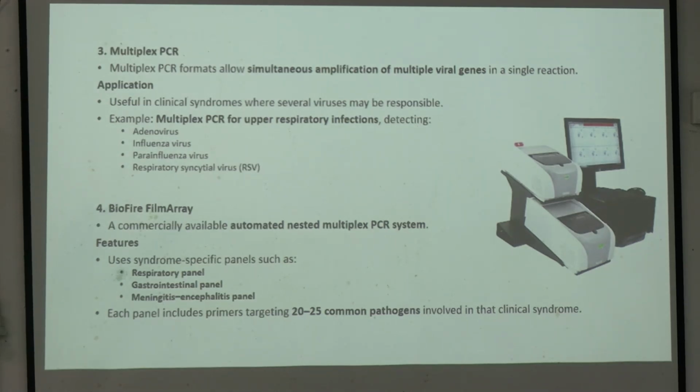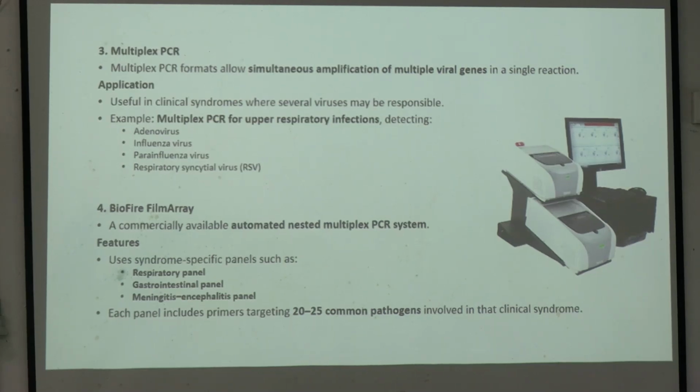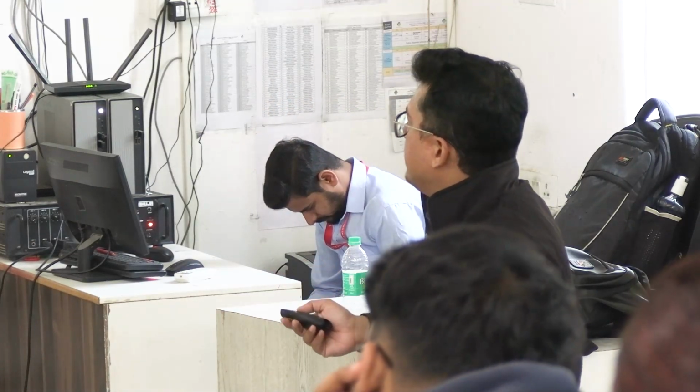So what you have to do is 3টে অর্গানিজমের প্রাইমার আমি ওর মধ্যে দিয়ে দিলাম। তা আমার যদি পেশেন্টটা হেপাটাইটিস বি আর এইচসিভি কো ইনফেকশন হয়ে গিয়ে থাকে, তাহলে আমার সব প্রাইমার দেওয়া আছে, আমি দুটো কার্ভ পাবো, একটা ফর এইচবিভি, একটা ফর এইচসিভি। That's multiplex PCR. মাল্টিপ্লেক্স মানে মাল্টিপল, যখন আমি প্রাইমার দিচ্ছি ফর ডিফারেন্ট টার্গেটস, ফর ডিফারেন্ট অর্গানিজম অর ফর দ্য সেম অর্গানিজম ডিফারেন্ট জিন, that is called a multiplex PCR.